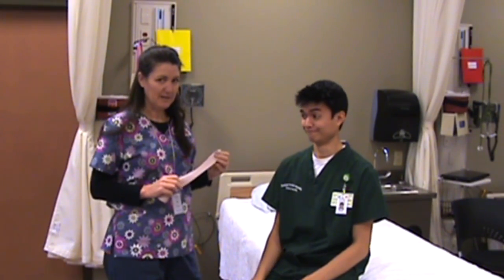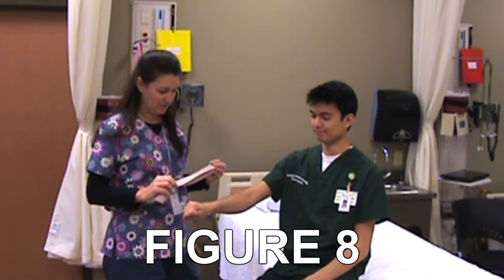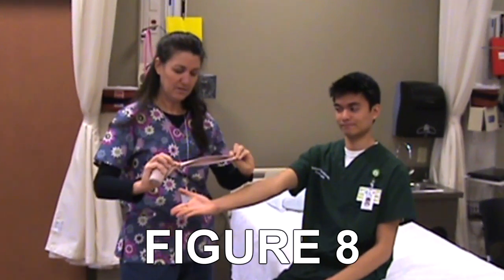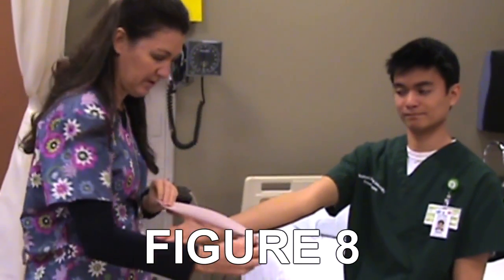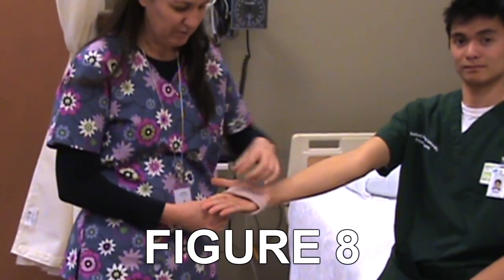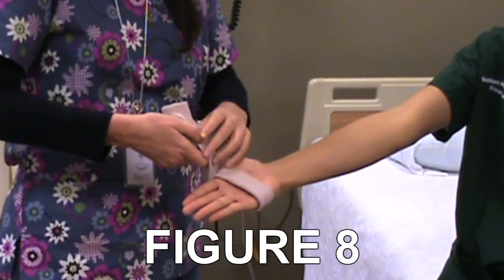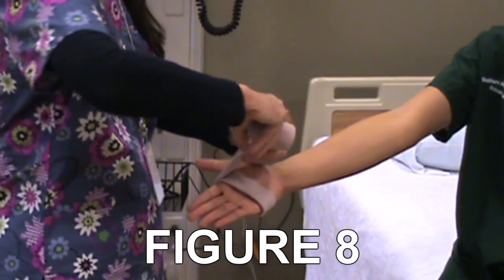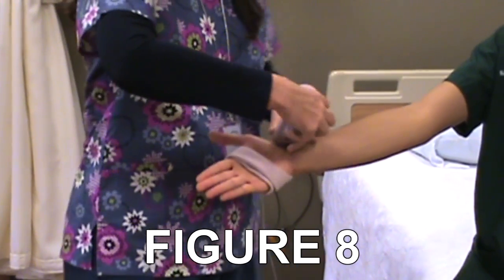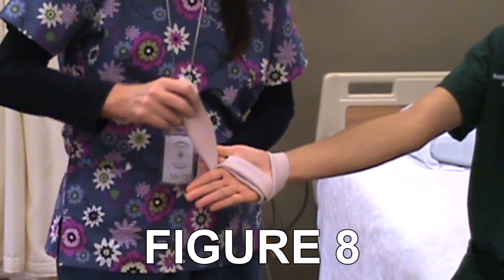Okay, I'm going to explain to you how to do the figure 8 on the ace wrapping. And I'll have my patient hold his hand up and hold his fingers out like that. I'm going to fold this over like this, and I'm going to put the folded part down, because if the germs come in, I want them to come in under just one fold instead of more than that. So I'm going to do the circular wrap around the hand, and then I'm going to do a little figure 8 here to stabilize it. I'm going to come up and just stabilize it a little bit more.